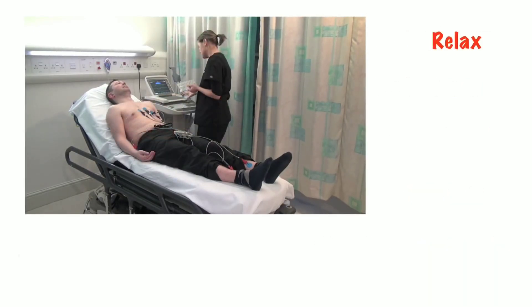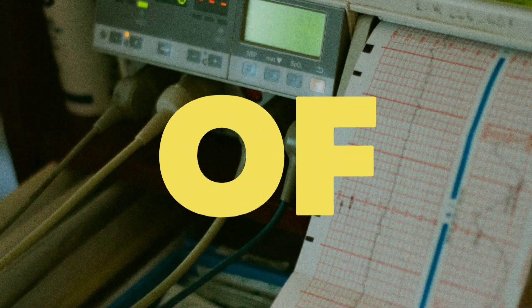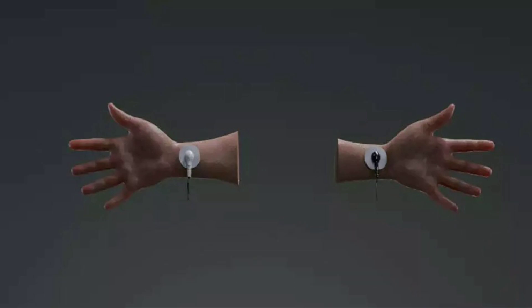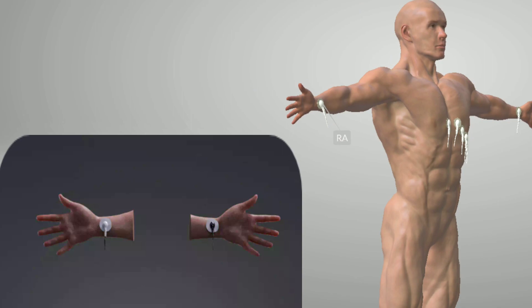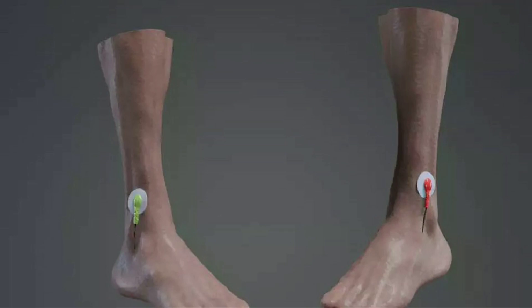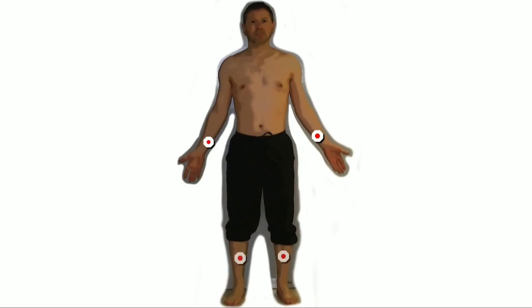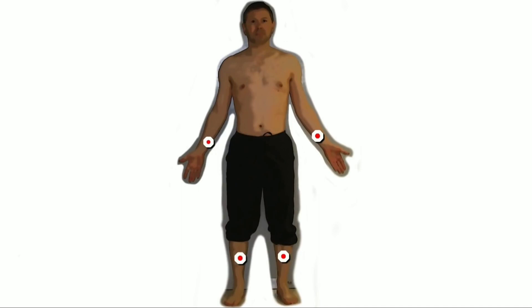Ask the patient to relax, breathe normally, and try not to move. For upper limbs, attach both electrodes preferentially above the wrist. If not possible, they may be placed anywhere on the limbs, but avoid bony areas. For the lower limbs, attach preferentially above the individual ankles. Similarly, if not possible, attach anywhere on lower limbs but avoid bony areas. For lower limb leads, you can also choose the medial aspect of the lower half of the tibia as a landmark.